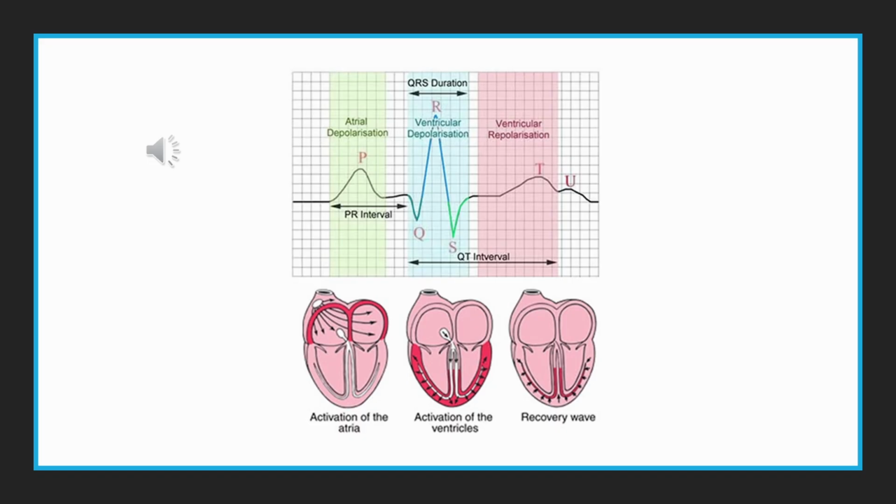All right, so here on the slide, we've got a picture which gives us a very comprehensive view of all the things we just talked about, which is how electrical activity on an ECG correlates, again, with what's actually happening within the heart, or that mechanical heart function. And this is so important. You have to understand how the electrical tracings correlate to what's actually happening in the heart, because that gives us a really good understanding of how any abnormalities or dysrhythmias are affecting our patient. So we're going to break down each of these ECG phases. Again, we've already talked about them, so this should just serve as a review.